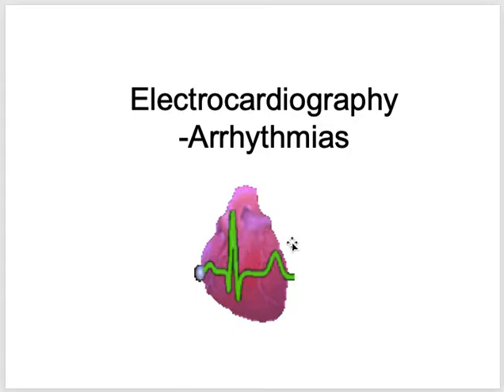In simple words, someone went into cardiac arrest, and if you had access to an ECG, you will see what the ECG is showing. Because if the ECG is showing any rhythm, based on that we can decide whether the rhythm is shockable or non-shockable. What is shockable?